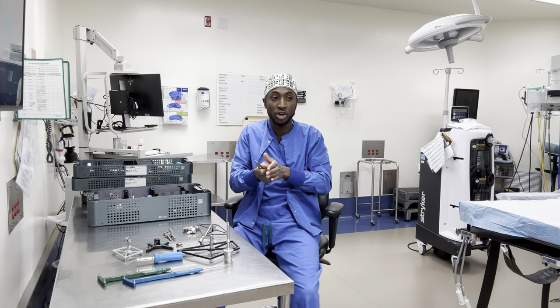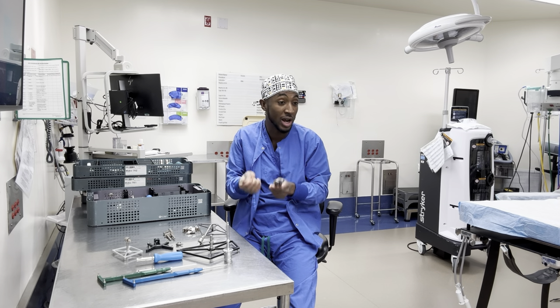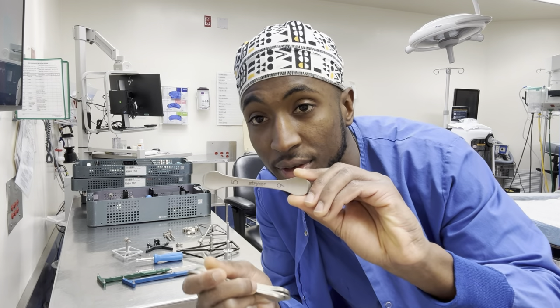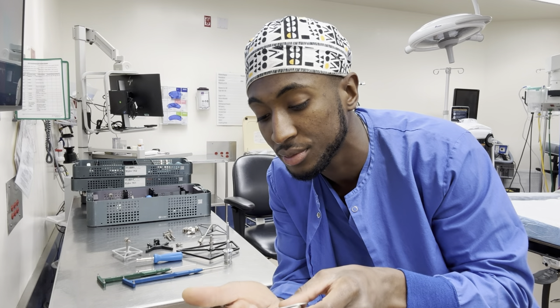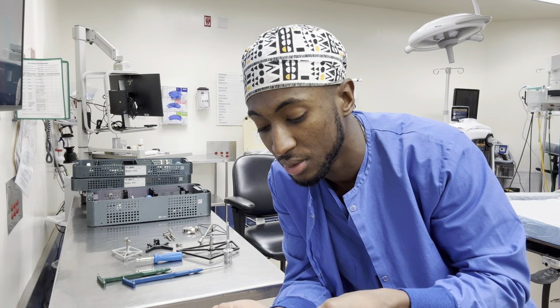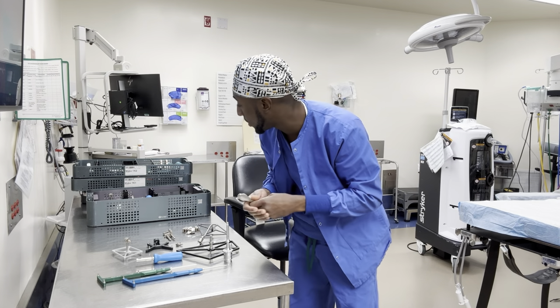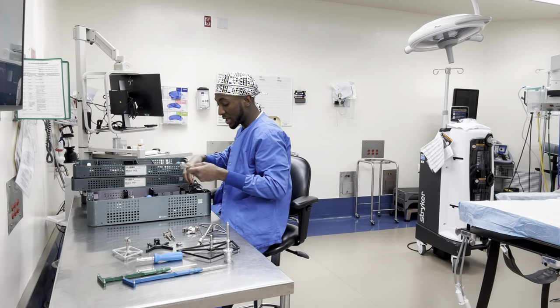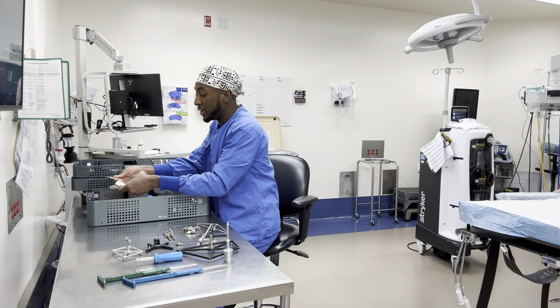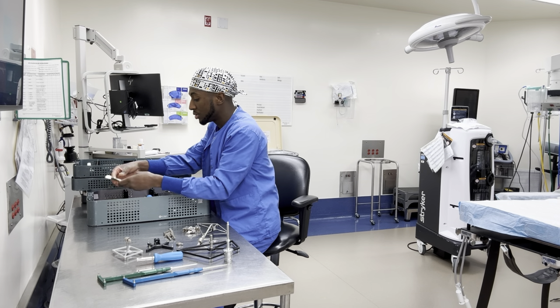Sometimes when they need to create a little bit more space in the knee when it's a little too tight, they put spoons in. Depending on how much space they need to create, they'll tell you the size spoon they need. You have sizes six, five, four, three, two, and one — two of each. I usually leave them in the tray and line them up based on size so they're easy to grab when called for.